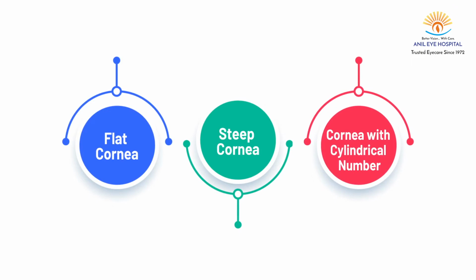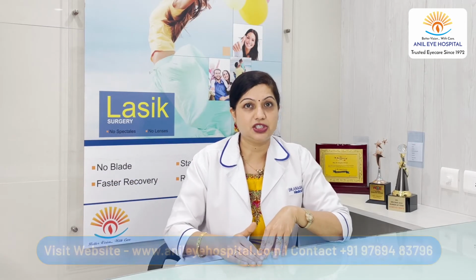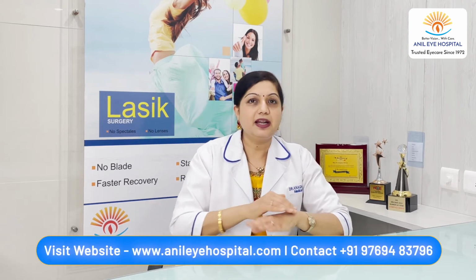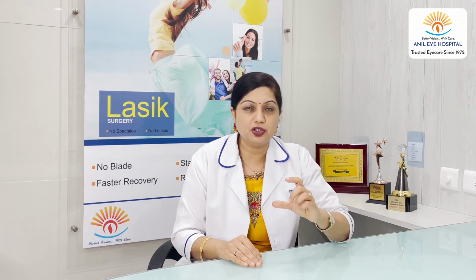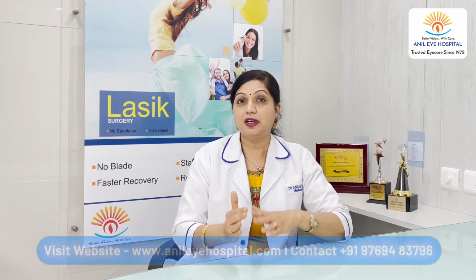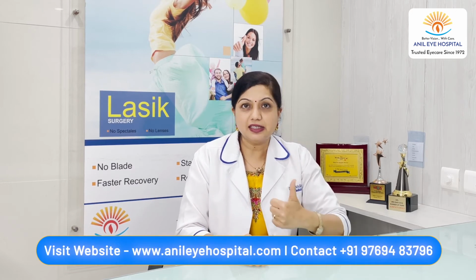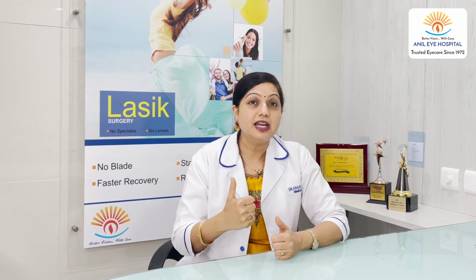In all these patients, we definitely prefer a bladeless procedure where the laser performs the flap, and irrespective of the curvature of the cornea or the thickness of the cornea, we get a very safe flap. So in many cases, we prefer a bladeless procedure to increase safety, and that is why bladeless procedure is the procedure of choice in most patients.